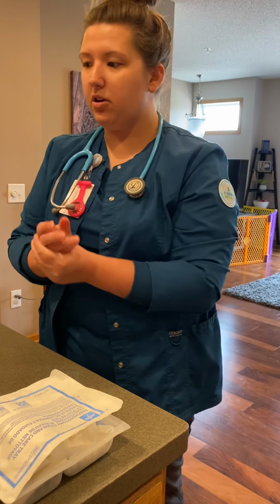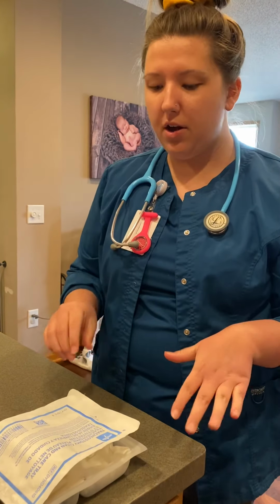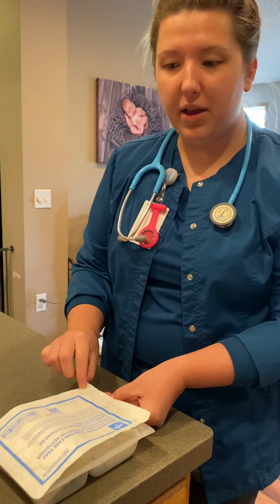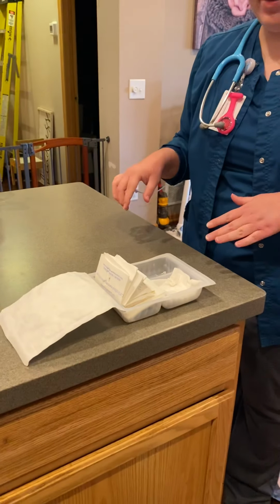So that is done. I'm going to additionally wash my hands here, and I'm going to start setting up my sterile field. So I have my sterile kit here, and I'm going to open it away from me. So I'm just opening it away. And then the first thing is I'm going to take out my sterile gloves.